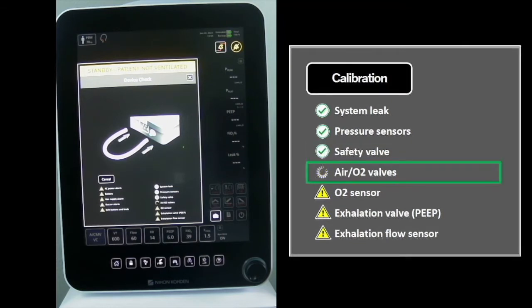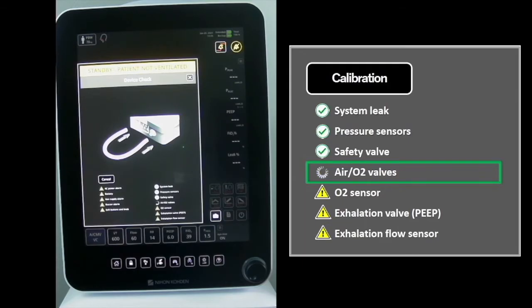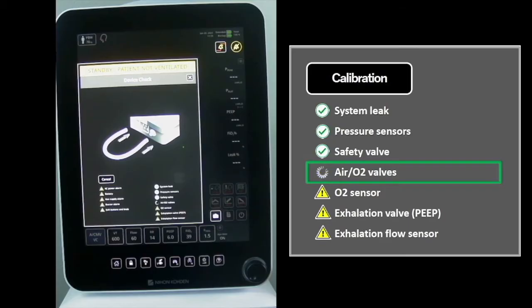The Air and O2 Valves Test is comprised of two stages. During the first stage, the air and oxygen PSOLs are tested for leaks. Leakage from either valve must be under 0.2 liters per minute to pass.